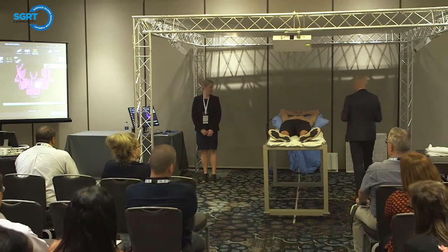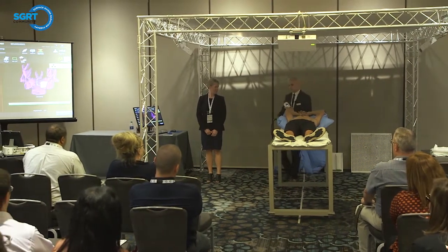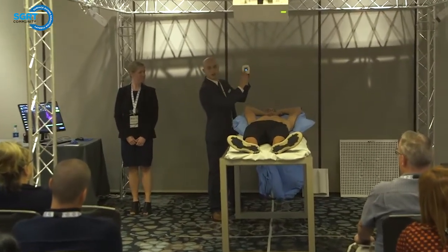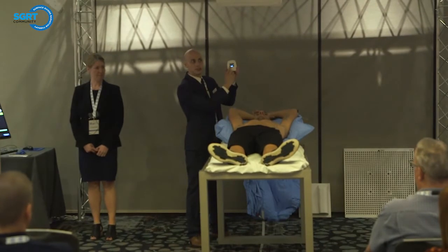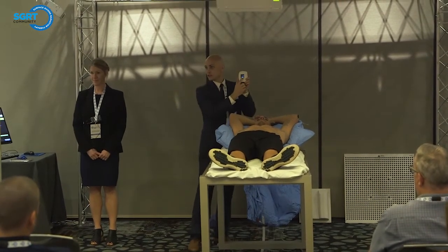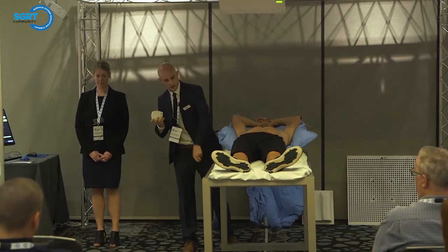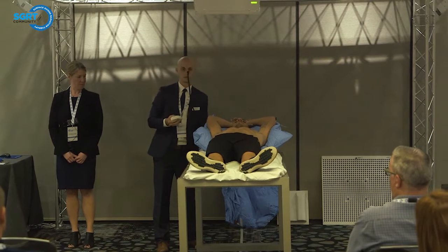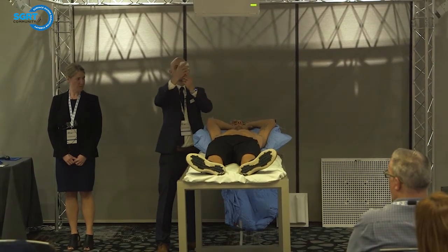This device is connected via Bluetooth. You can see there's a small icon here, a solid Bluetooth symbol saying we are connected to the system. Then you have a flashing play button telling us it's waiting for us to begin monitoring. This device just connects to a gooseneck that's connected to the table via clamp, and there's a few different sizes of that.